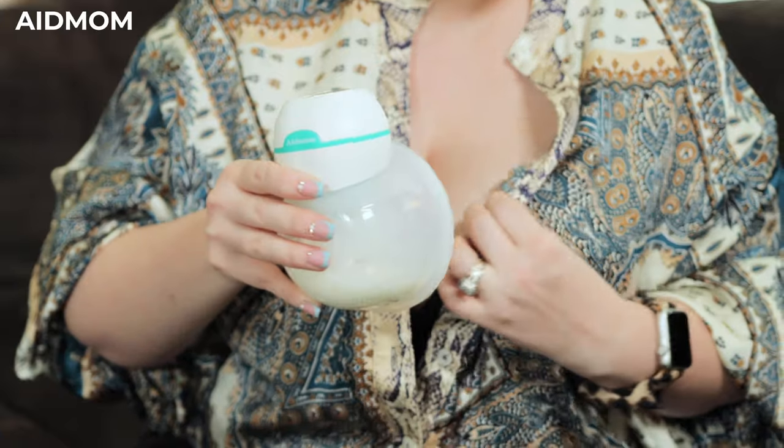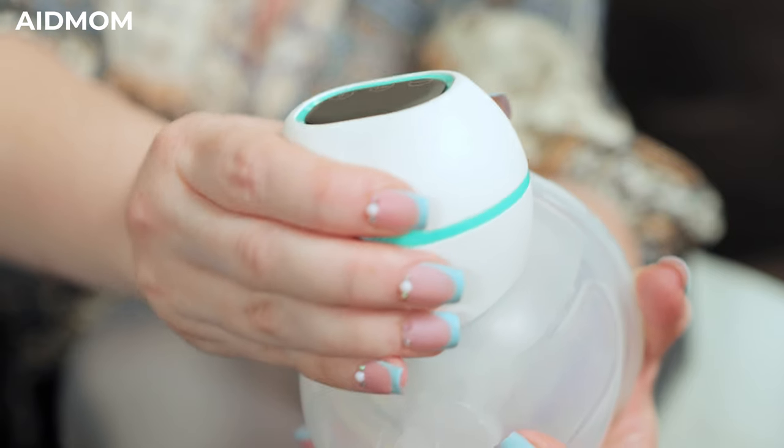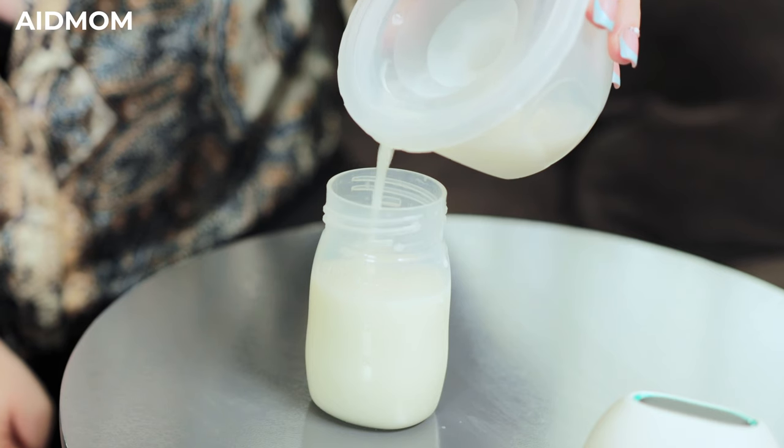With our anti-backflow design, there is no longer any need to worry about leakage. Before pouring the milk into a jar, take off the motor first.